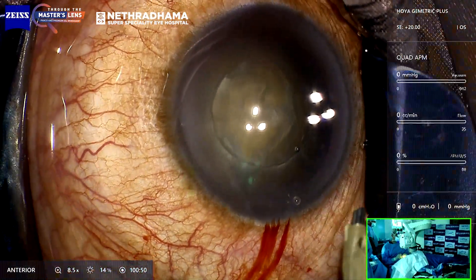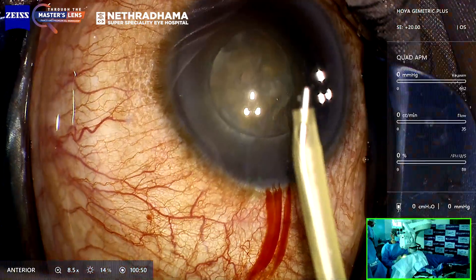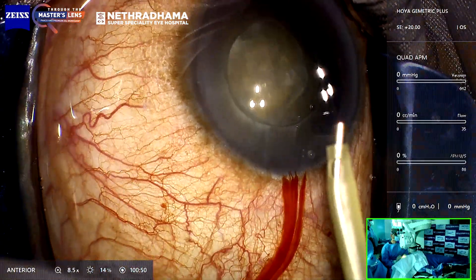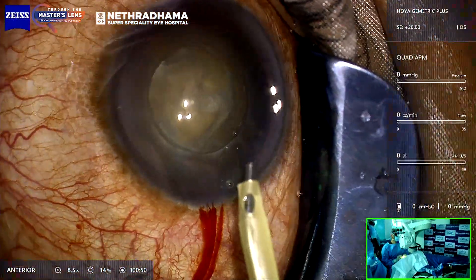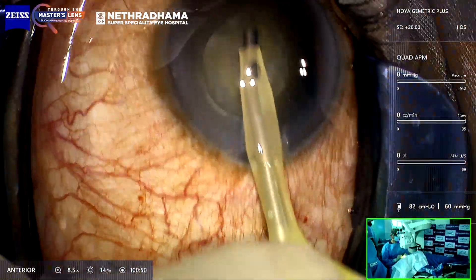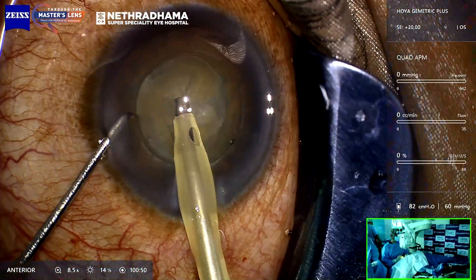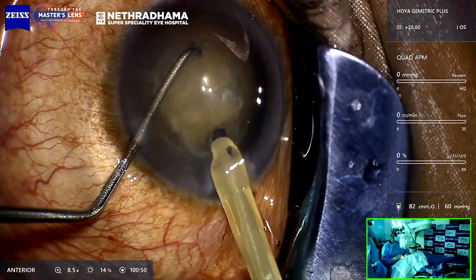I'll be using the Quatera with parameters of 700 vacuum in vacuum mode, meaning it acts like a venturi pump. This is the new tip for the Quatera — it's a 45-degree bend tip, like the Kelman tip — goes in through a 2.2 mm incision. I'm using a 1.25 sharp chopper and I'm going to do a direct chop.